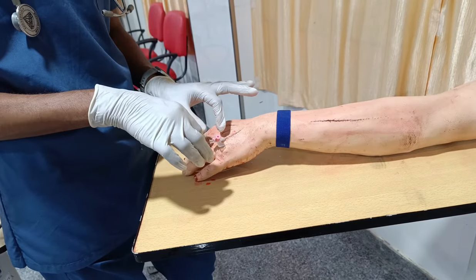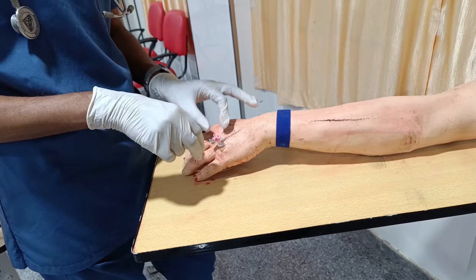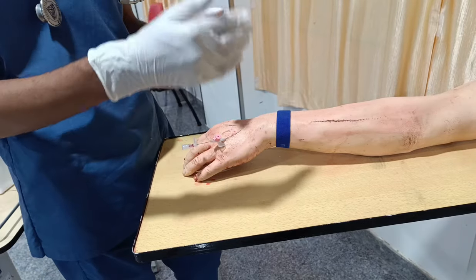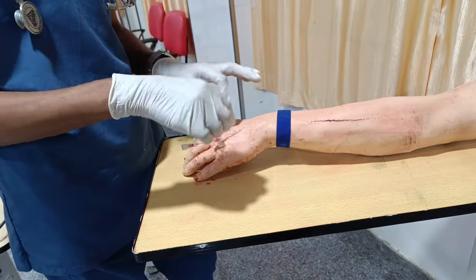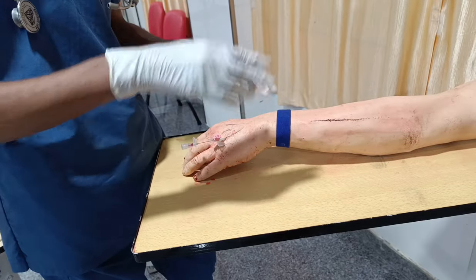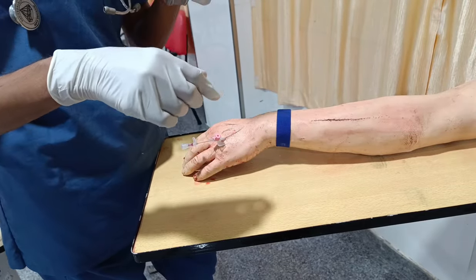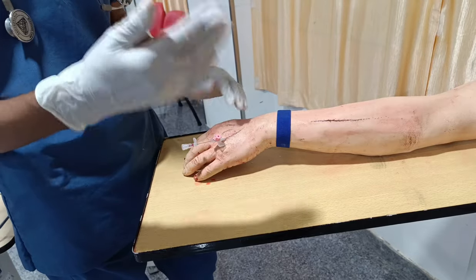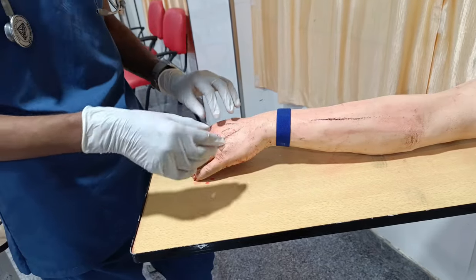While withdrawing with one hand, with the other hand you can introduce the plastic portion alone. If you are going extravasation, you can clearly see the resistance. If you are intraluminal, the catheter will pass more smoothly. Those are some findings you can experience at the time of IV cannulation.